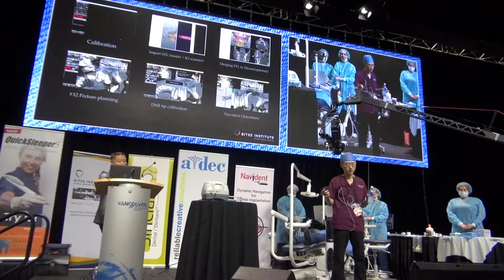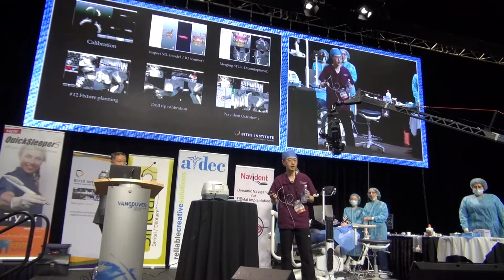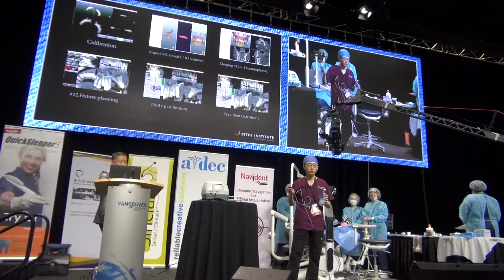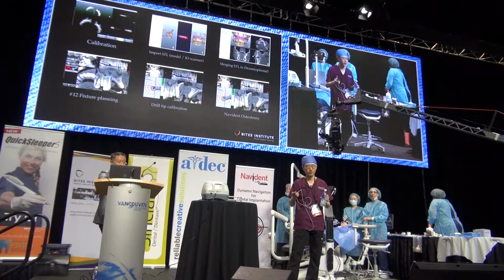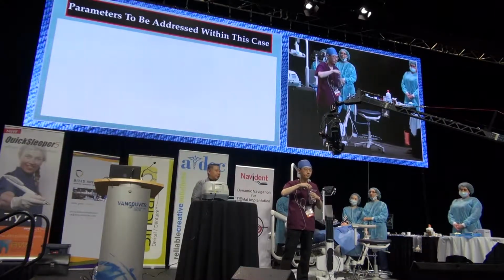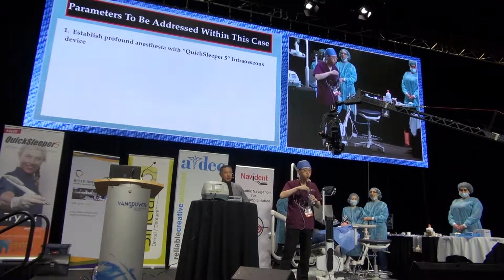mouth. One of the most important things about implant dentistry, especially aesthetic implant dentistry, is planning. If you fail to plan, Dr. Mark Lin will say, okay, you better plan to fail, okay? The parameters with this case are a few learning points, objectives we're trying to establish.